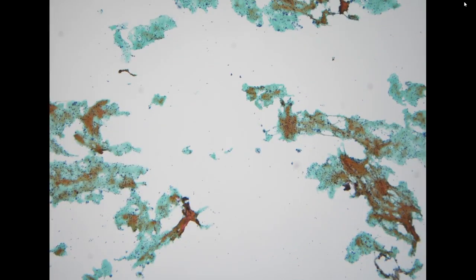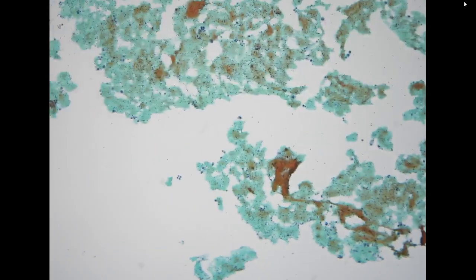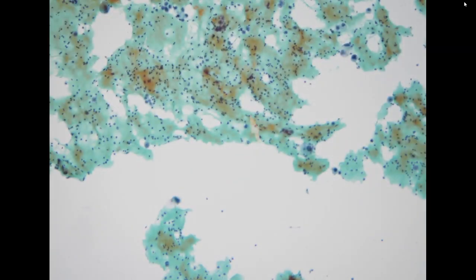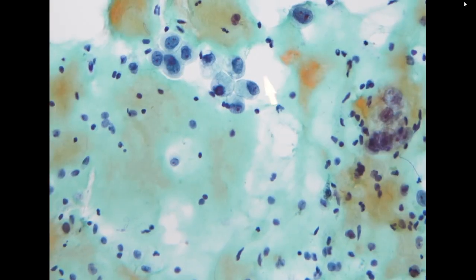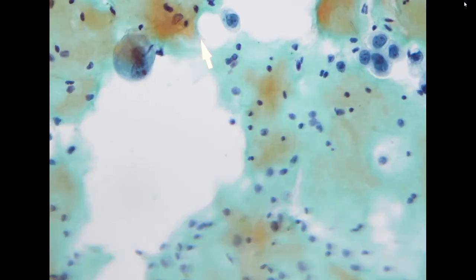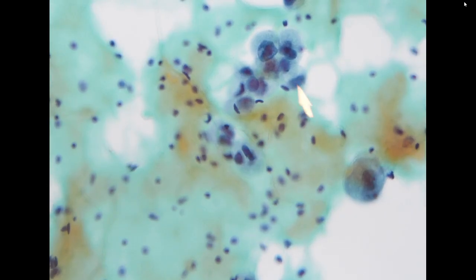Again, this is a recurrent tumor, adenocarcinoma of primary lung. Again, you can see more proteinaceous material in the background. But there are still positive cells admixed with this proteinaceous material, and this is also high-grade adenocarcinoma. So this is positive for recurrence.